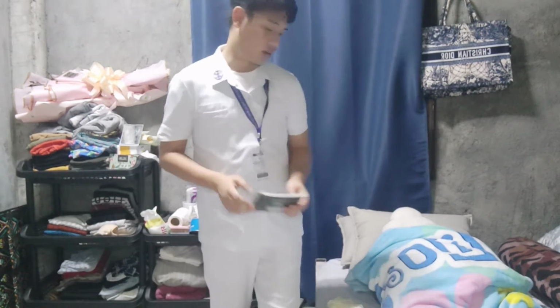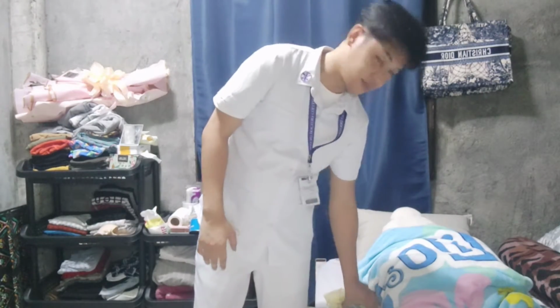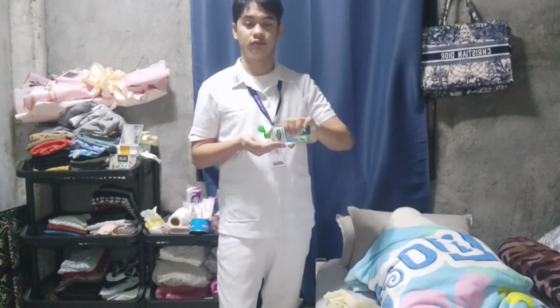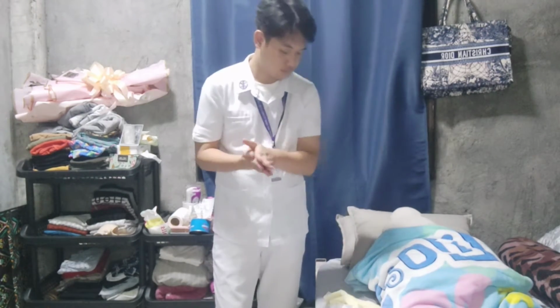The next one is I'm going to perform hand hygiene and observe other infection prevention procedures. This is to deter the spread of microorganisms. I'm going to use this antiseptic alcohol. Next, we need to prepare the medication vial for drug withdrawal.